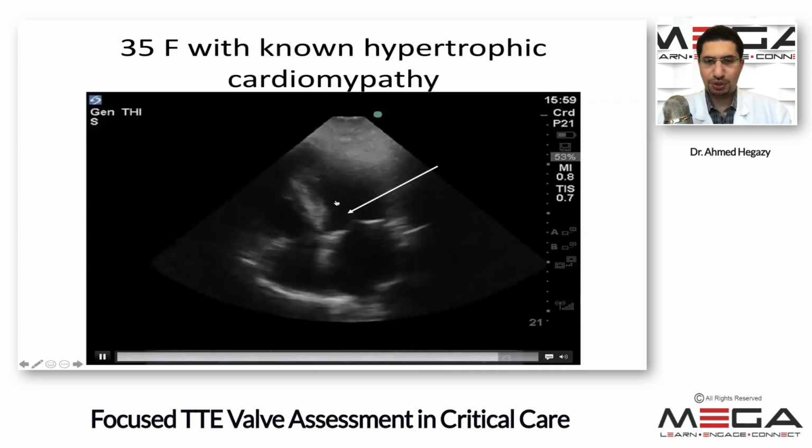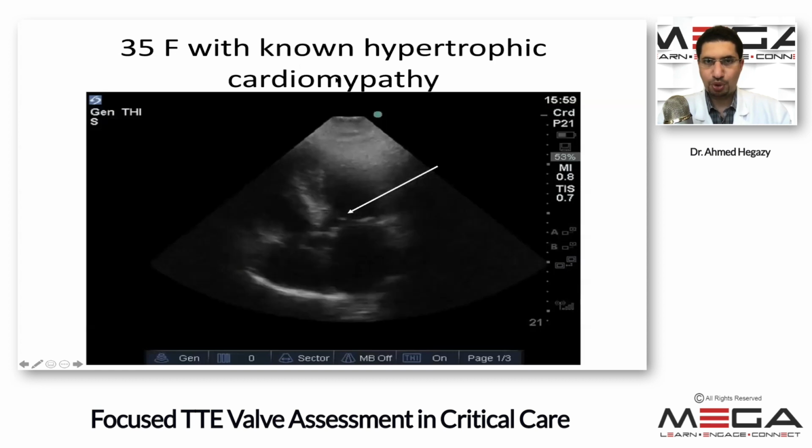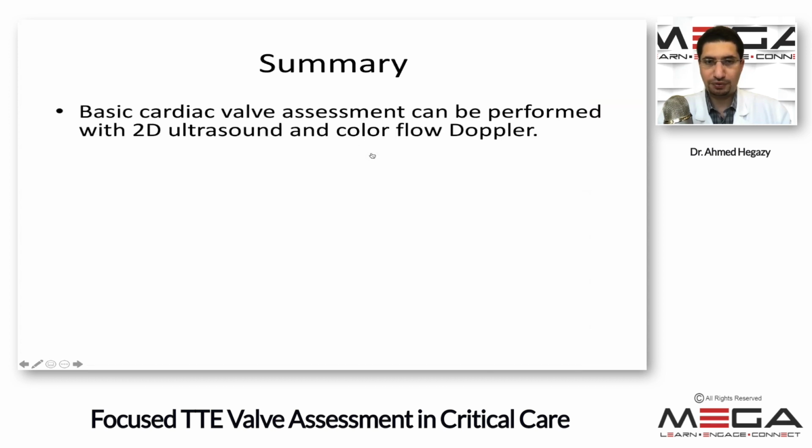This is something you would need to assess in any patient presenting to the ICU with hypertrophic cardiomyopathy, or any patient as well presenting post mitral valve repair. You tend to see that quite often.